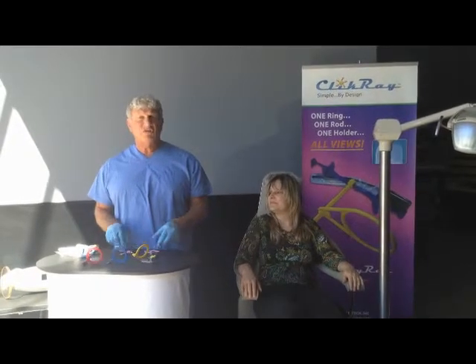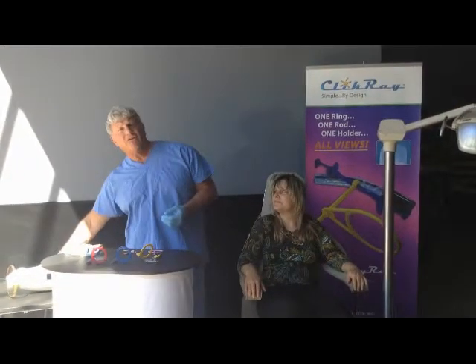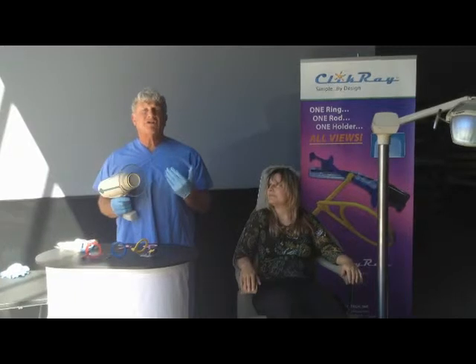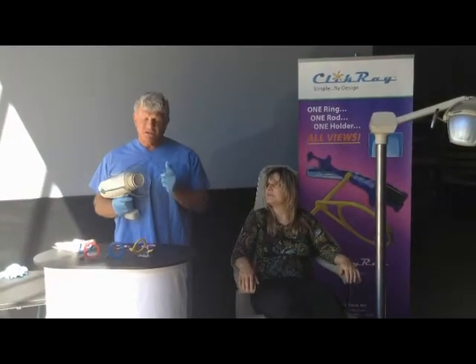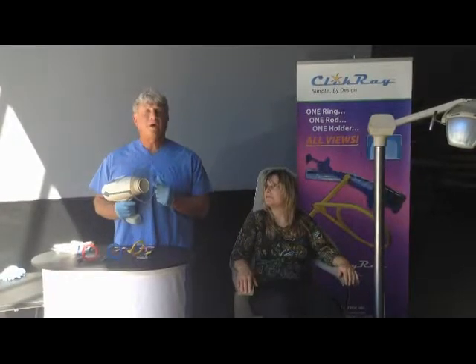Traditional systems generally have three rings, three rods, and multiple bite blocks to accomplish this. The drawbacks are very simple and very obvious. When you're using a handheld unit such as a Nomad, you're unable to get close and accurate x-rays because the scatter shield is prohibited from getting closer due to the rod that exists.